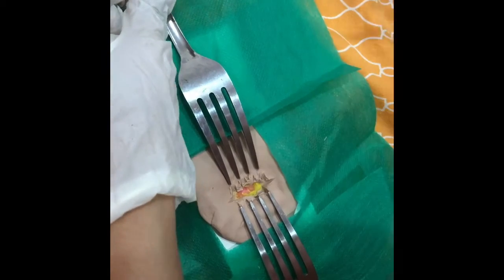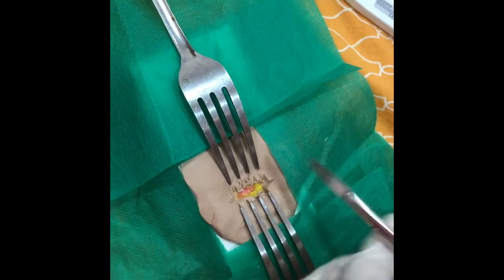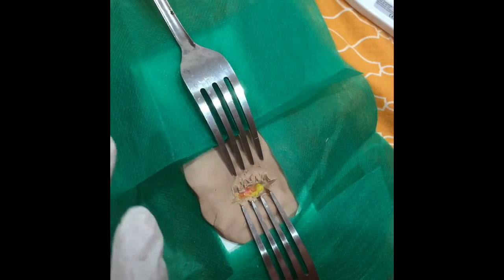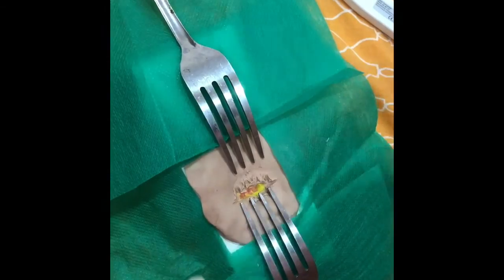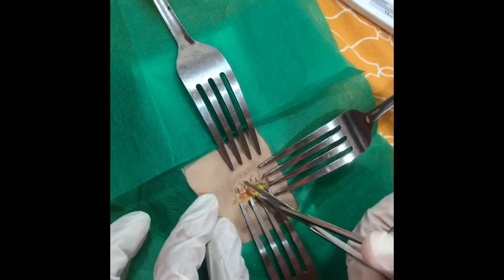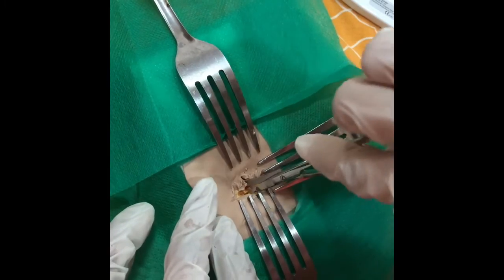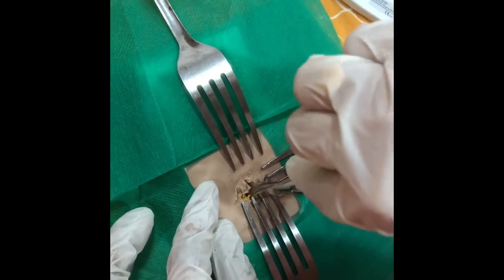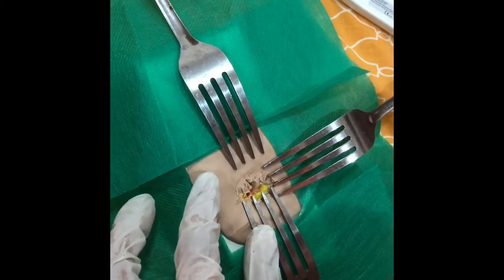The strap muscles should be divided in the midline raphe and should be reflected laterally. The thyroid isthmus can be mobilized so as to expose the anterior trachea, or it can be divided. If the isthmus is divided, care should be taken to address any bleeding from the edges of the gland prior to opening the airway. The cricoid hook should then be used to secure the airway superiorly and anteriorly.